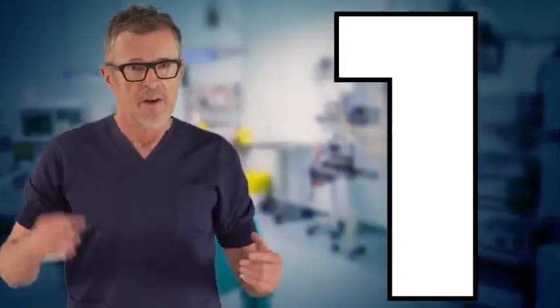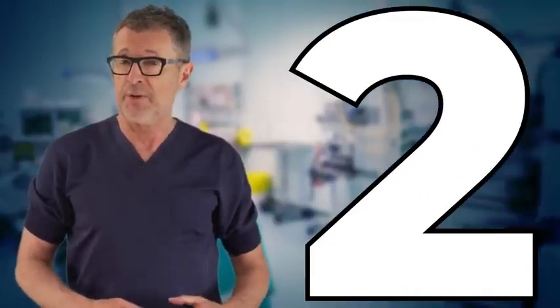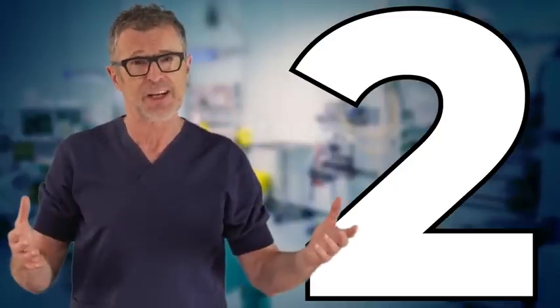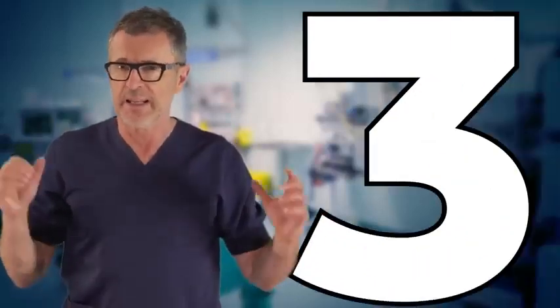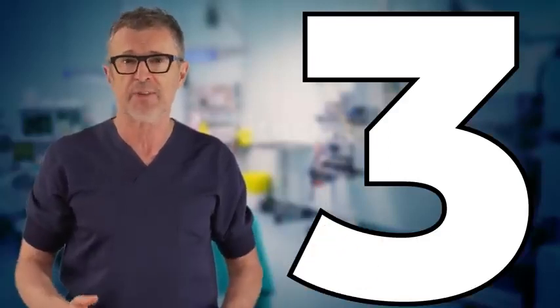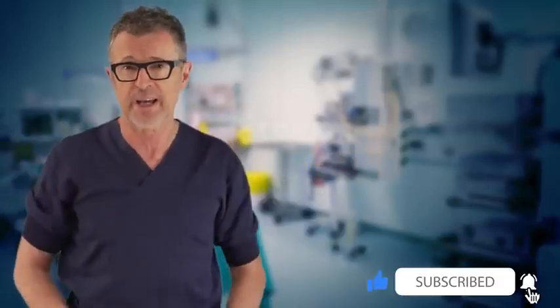And these are the three most common reasons why IV catheters fail. The catheter is too short, reason number one. Number two, the catheter needle system was not placed long enough inside the lumen of the vein to allow for enough slack so that the catheter does not migrate into the subcutaneous space. Reason number three, the angle of catheter needle system insertion is way too steep, and the operator does not have a chance to recorrect it and advance it sufficiently long inside the lumen of the vein.